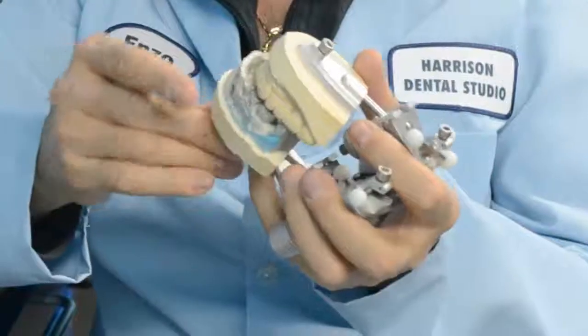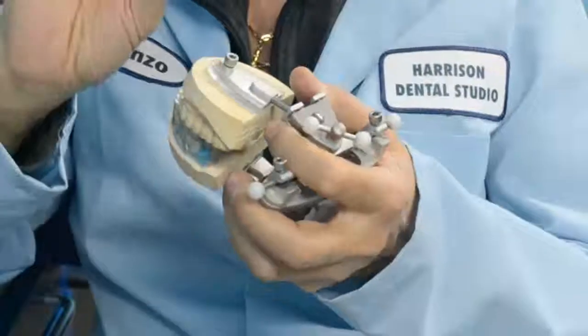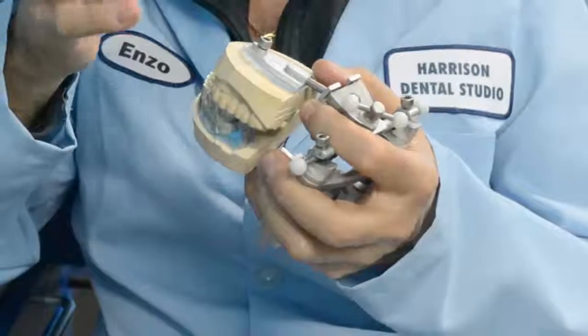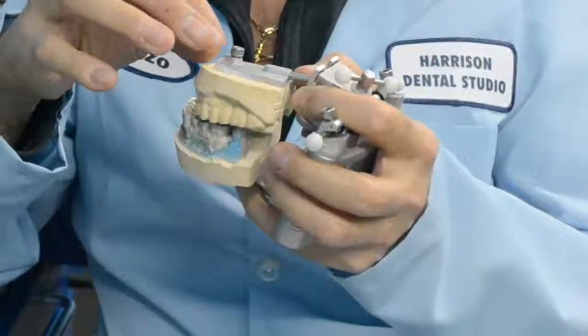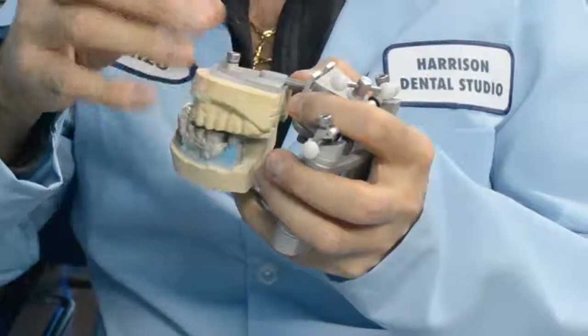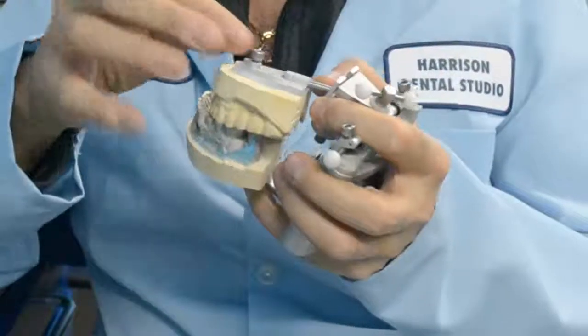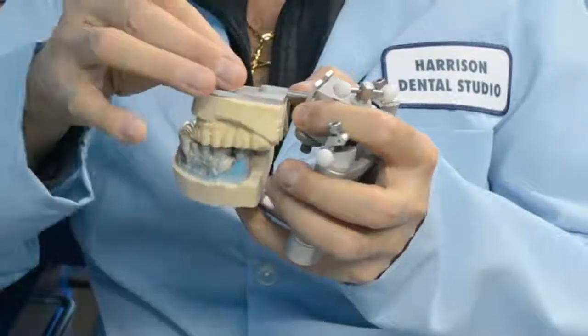It moves vertically up and down to accommodate anything. The screw on the male has a little prong on the end. The prong will make a dimple into the plastic female. Once you put it in place, you can take the model on and off, and it will go back into place every time — 100%. The dimple will fit in, and you're able to do it every time.